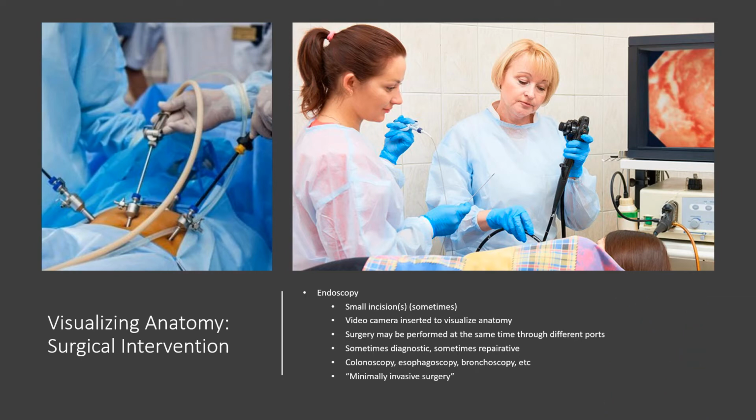So for example, if you're doing an esophagoscopy or a bronchoscopy, let's say, you're not going to cut inherently to do that. You're going to stick a tube down somebody's throat into their bronchial passages and see them. There's no cutting involved in that. But while you're there, if you see diseased tissue that you want to be able to characterize, you may then also bring in surgical tools through the same passage to take a sample of tissue for examination for pathology. Taking a little sample of tissue for examination is taking a biopsy. So that would be an example of a diagnostic endoscopic procedure.